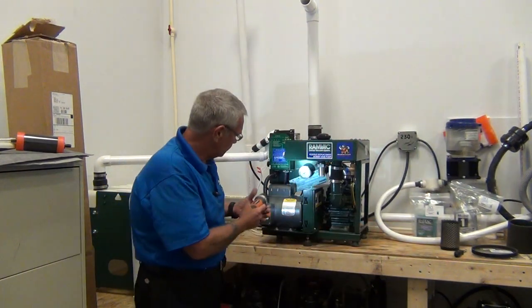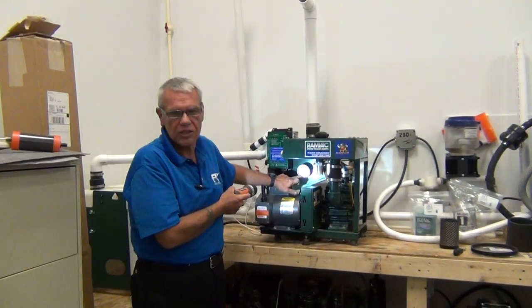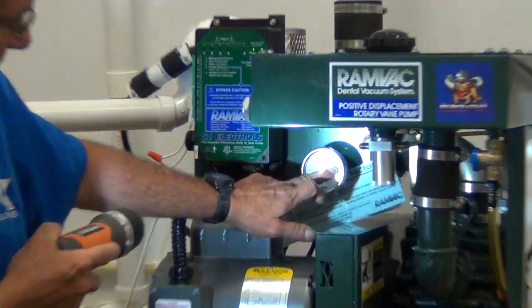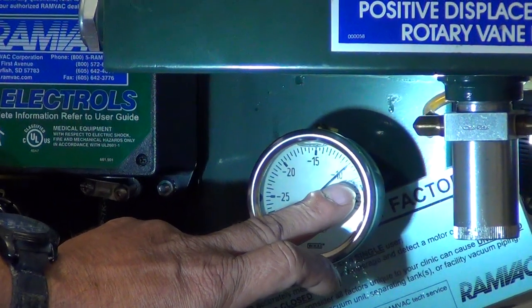I light this with a flashlight. Here's our gauge, which is read in inches of mercury. The gauge says we're reading at 10 inches of mercury.